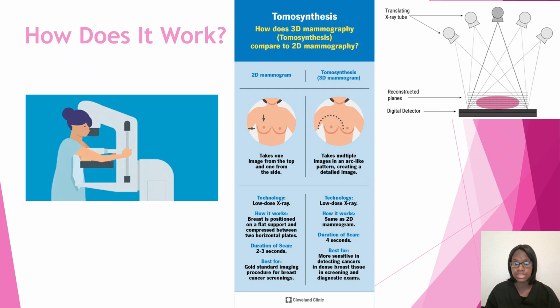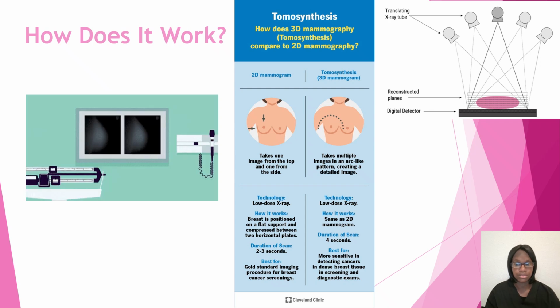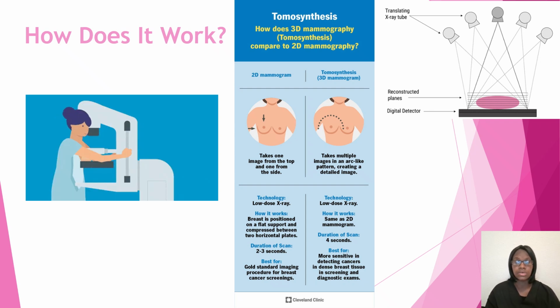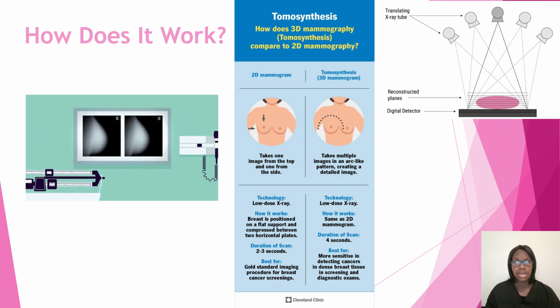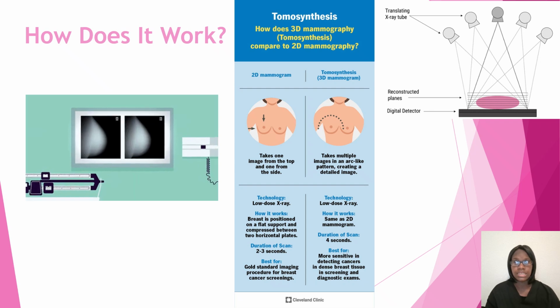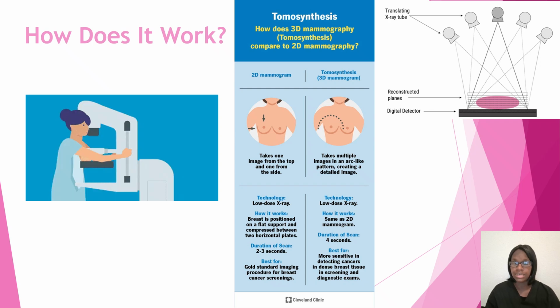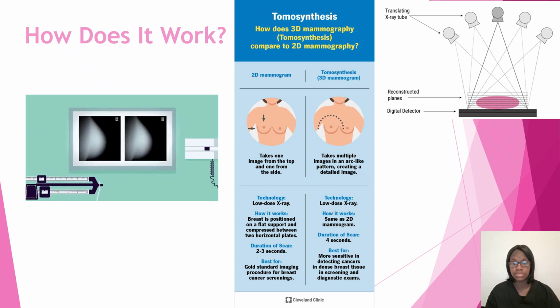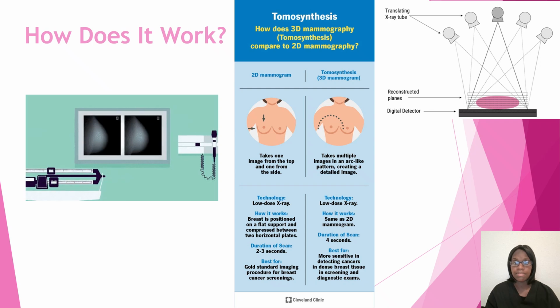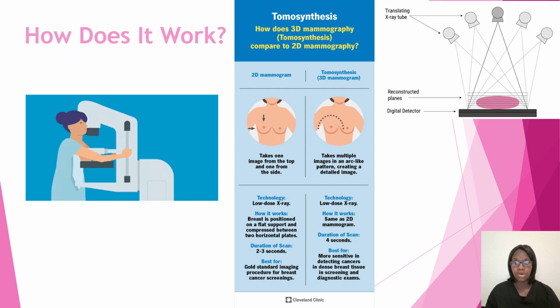It takes about 2 to 3 seconds for the patient to hold their breath and then the image is taken, and afterwards they're done. So it's not a long image like the one you would take for your 3D. At my facility, we do the 3Ds in combo HD. If you pay attention next time you work in mammography, or you're a student in clinic, pay attention to what images y'all are taking for your 3D.